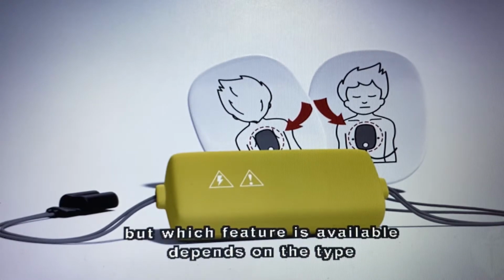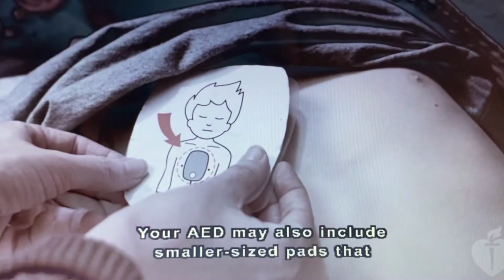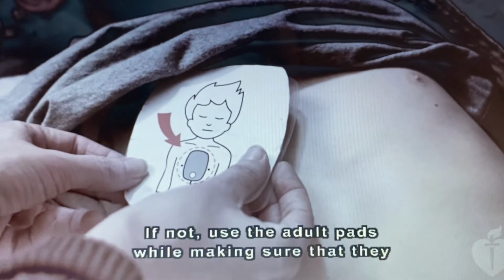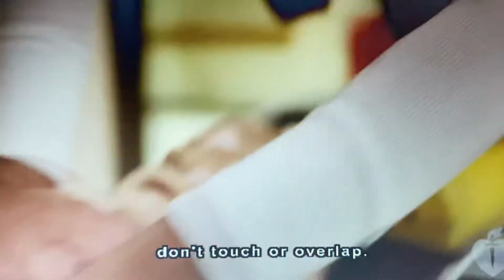But which feature is available depends on the type of AED you're using. Your AED may also include smaller-sized pads that are designed for children under 8 years of age. If it does, use them. If not, use the adult pads while making sure that they don't touch or overlap.